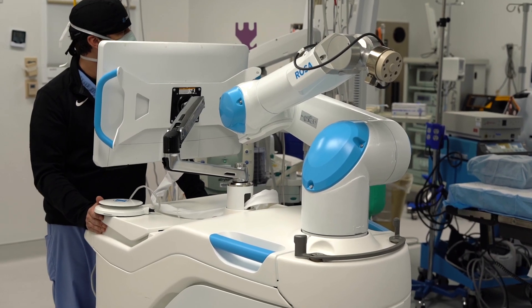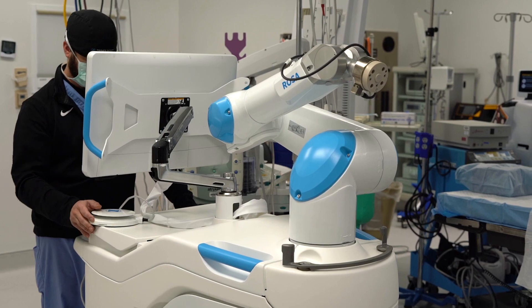The ROSA is basically a computer system — we call it a robot as well — that we use to do hips and knees. The ROSA is a new technology; it's been out for a couple of years, but it's built on technology that's been around for about the last 10 to 15 years. We've been doing total knees here for probably the last one to two years.